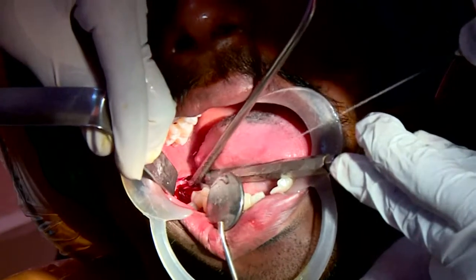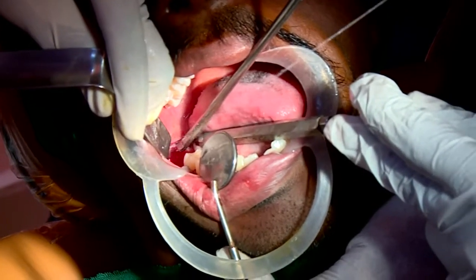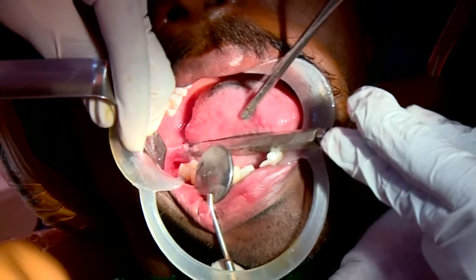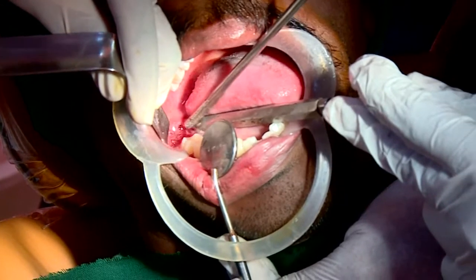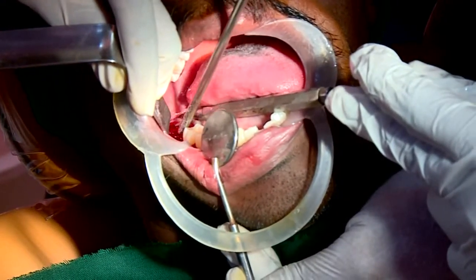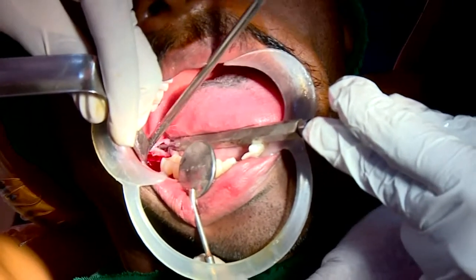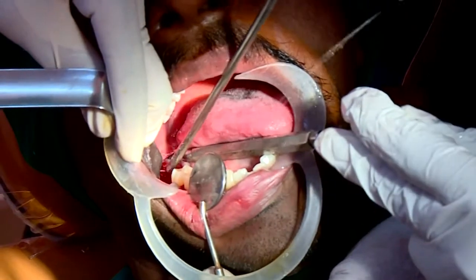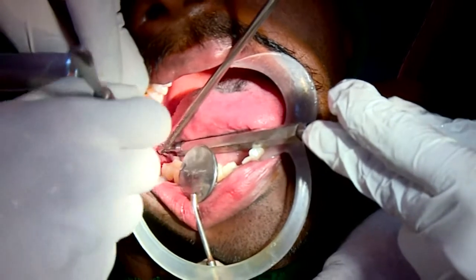Once the tooth is removed, copious irrigation with saline is required to check for any fractured crown pieces, because we have sectioned the crown into 3-4 pieces. Any small remnants may cause delayed healing. After this, we have to move on.